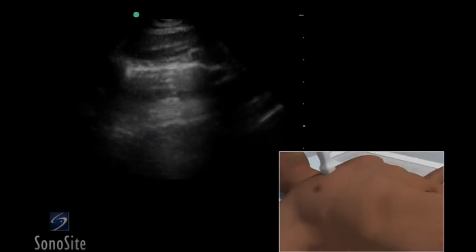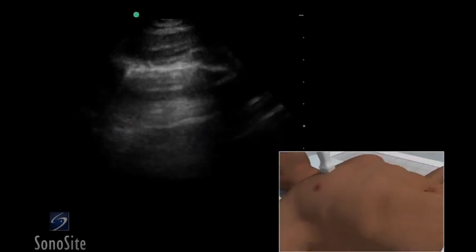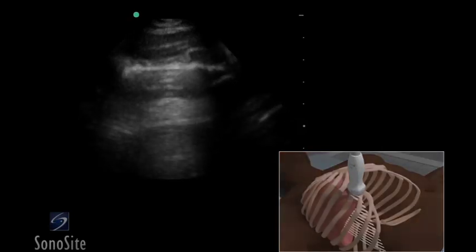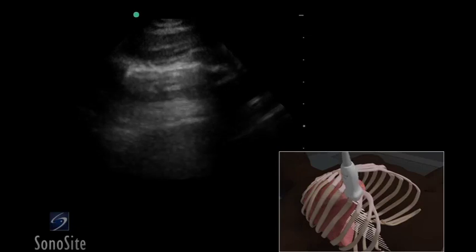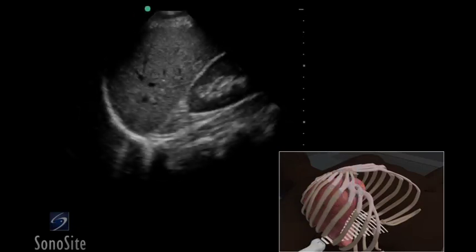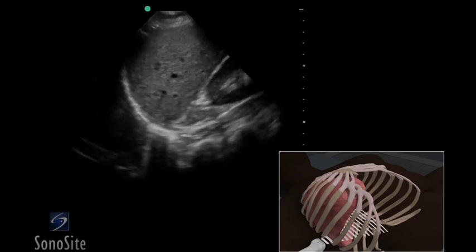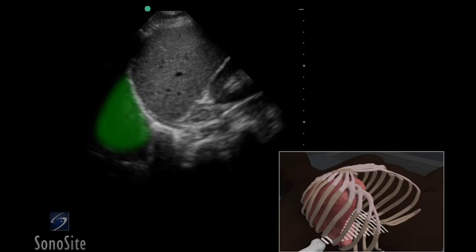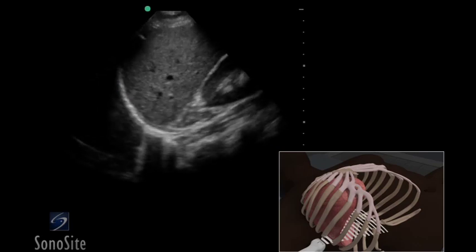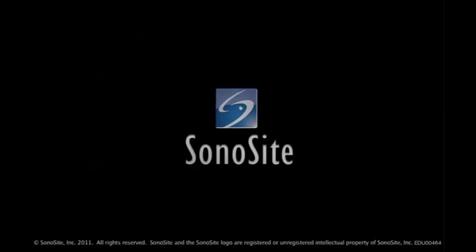To evaluate the posterior pleural space, move the transducer distally to the level of the seventh intercostal space. Slide the transducer posteriorly to the midaxillary line. Increase the scanning depth to view the interface between the pleural space and diaphragm. In a normal patient, a mirror image artifact of the liver or spleen will appear above the diaphragm.